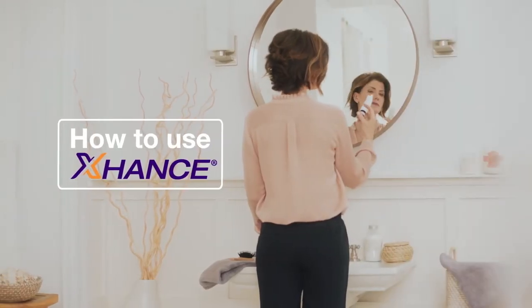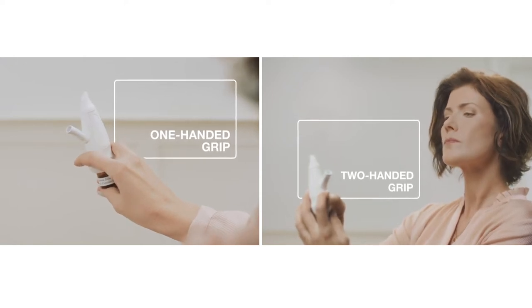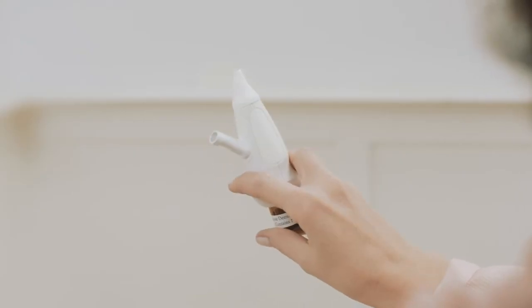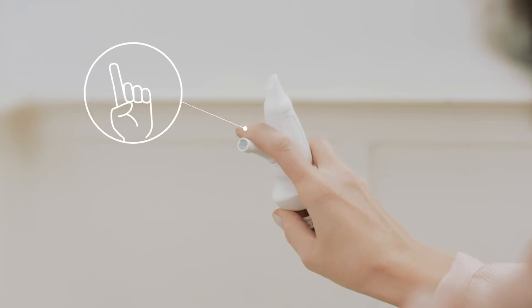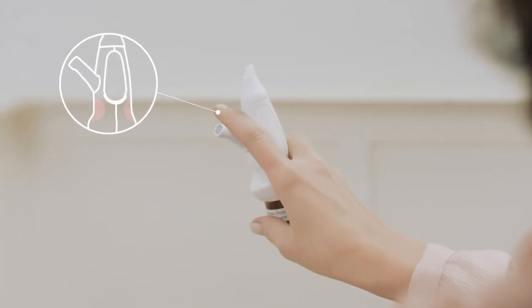Now let's see how to use Exhanse. It is important to remember to shake Exhanse before each use. Also, ensure you have the correct grip. Using one or two hands, place your fingers on the indented grip below the flexible mouthpiece. You want to keep it below the mouthpiece. There you go.